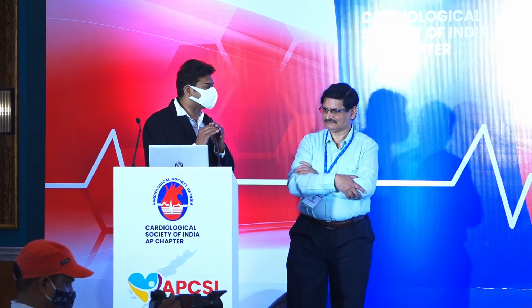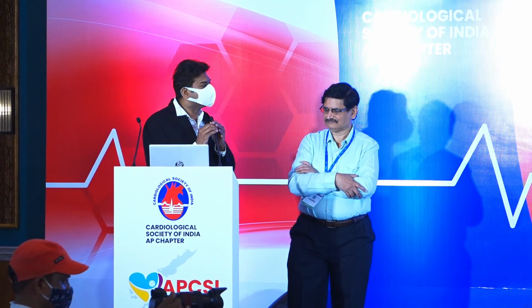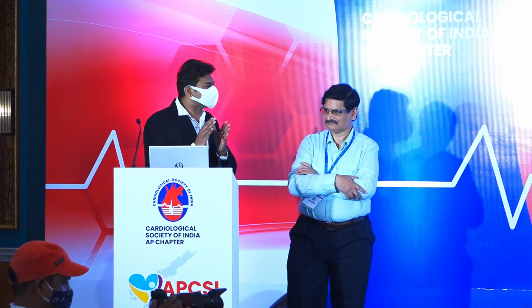And I would put it this way, I would try combining both. For example, aorto-ostial lesions, in left main lesions, for example, left main bifurcation you are doing. So there is an ostial lesion as well as distal left main and everywhere. If you are trying to do only IVUS, you would not get the benefit of OCT. But if you are trying to do only OCT, you would end up not doing well at the ostium.